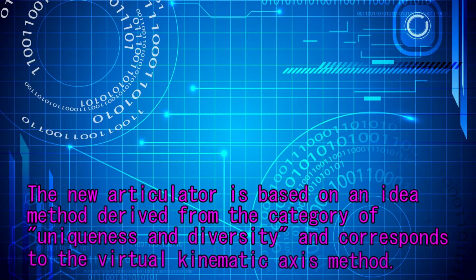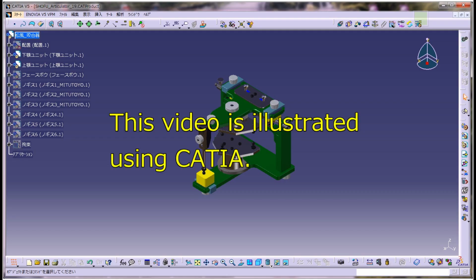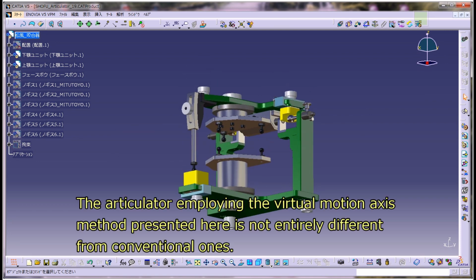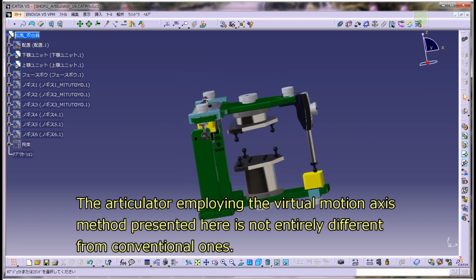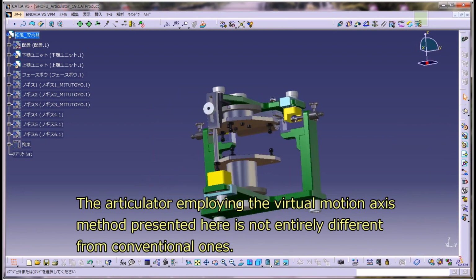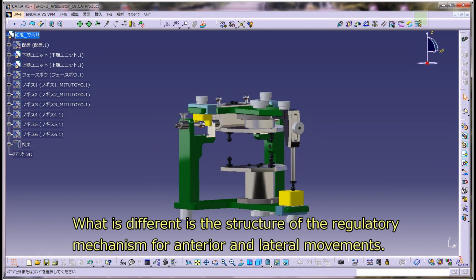The new articulator is based on an idea method derived from the category of uniqueness and diversity, and corresponds to the virtual kinematic axis method. This video is illustrated using CATIA. The articulator employing the virtual motion axis method presented here is not entirely different from conventional ones. What is different is the structure of the regulatory mechanism for anterior and lateral movements.